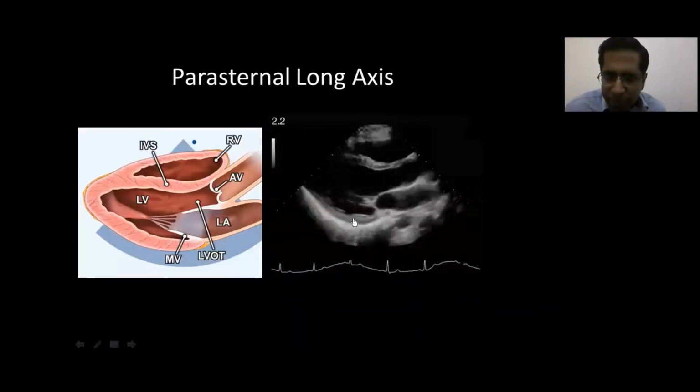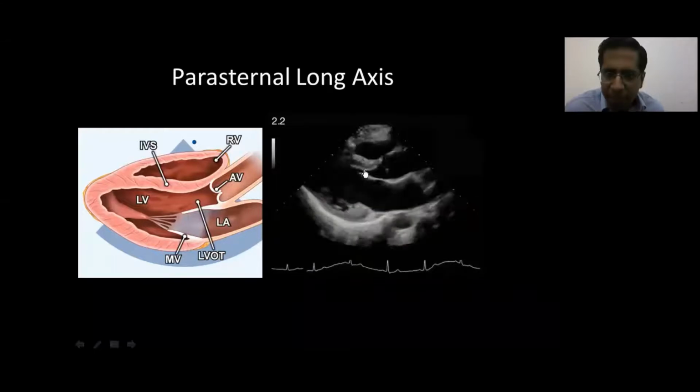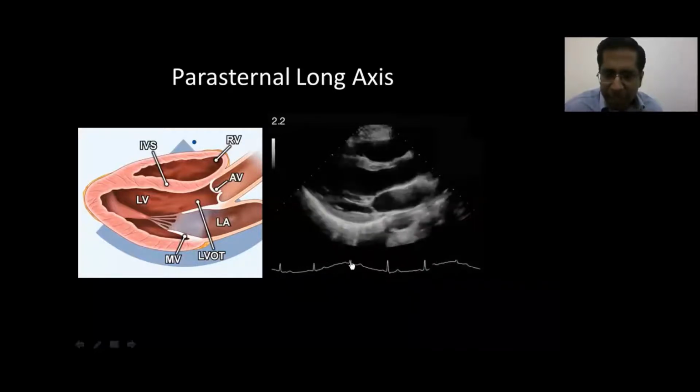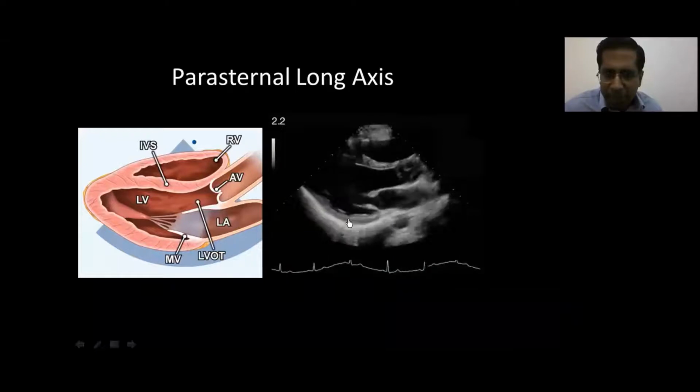The other thing to bear in mind is to make sure that you see the compacted myocardium nicely, that the endocardial border is clearly seen and it is not fuzzy or hazy. The final thing is that you should always try to gate it with an ECG and acquire at least 3 beats when you take this particular view or any other view that follows. That is extremely important.